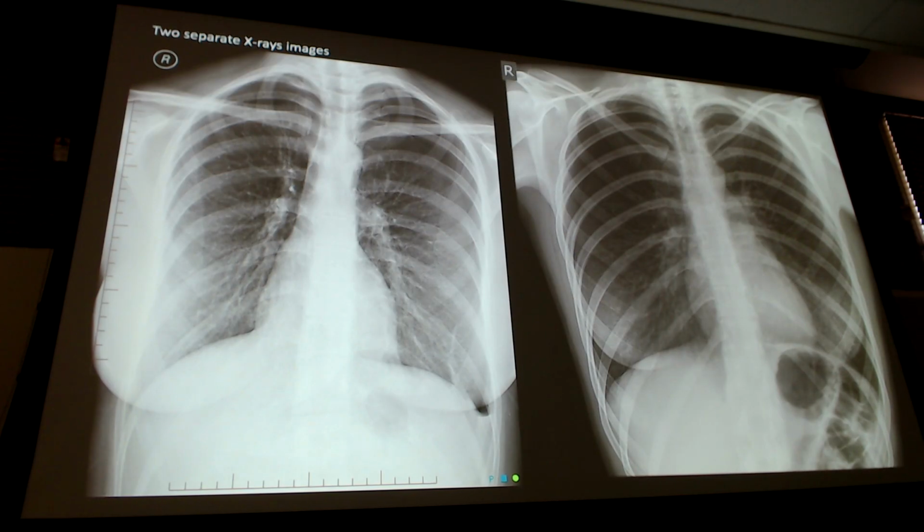Yes, sir. Does the pneumothorax always follow the entire course of the lung from top to bottom, or would it just be like the top half, where you can see that space? Good question. No, it does not always follow the course of the entire lung and the entire thorax. It depends how severe it is. It will always have the generalized shape of the thorax, but it could just be this portion here. It can absolutely be just a superior portion and working its way down. It does not have to be the entire thorax or the entire lung.